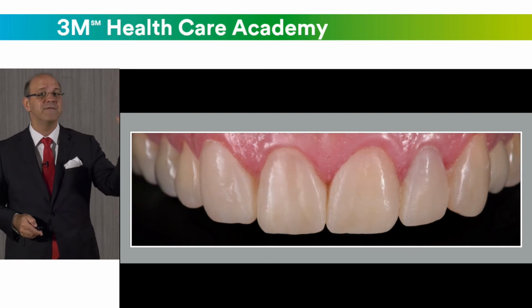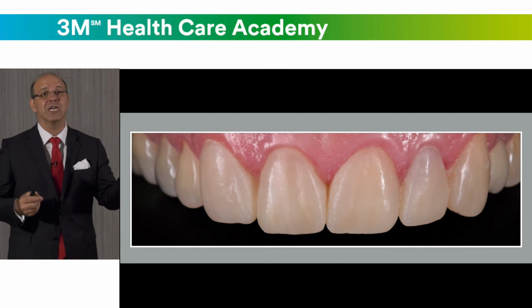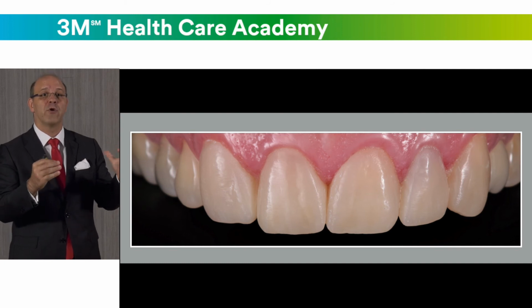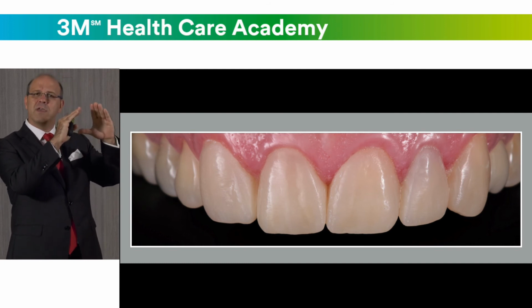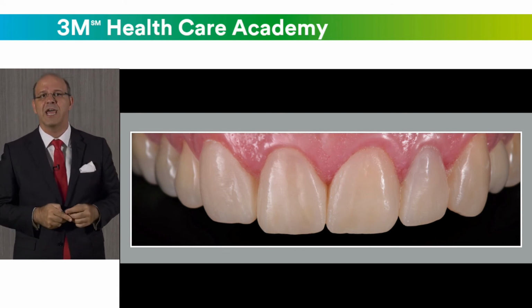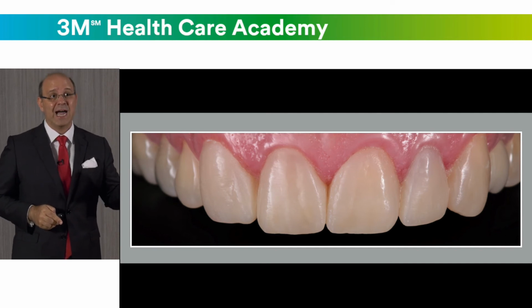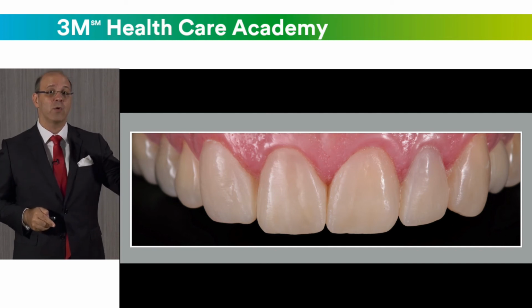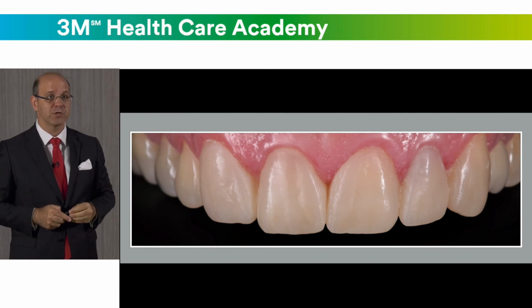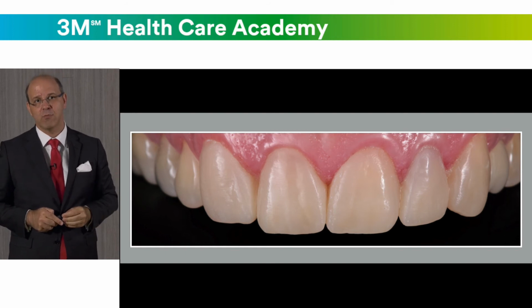Usually the veneers are made in enamel, and to bond the veneers we use dentin. The composite that we use to bond the veneers on the tooth will fill all the space so the tooth looks completely natural. With this kind of technique, in some cases, it can be done in just one appointment, and we can also have a natural outcome with the restorations.